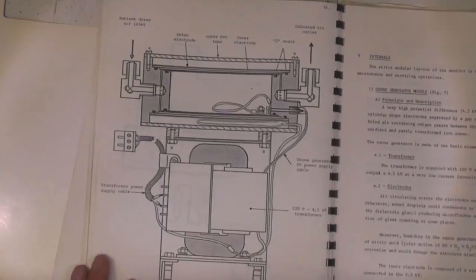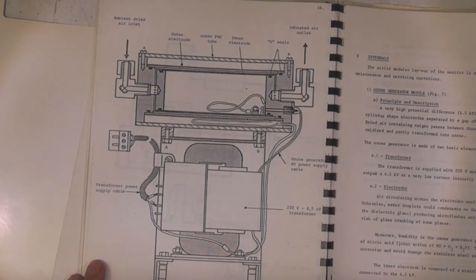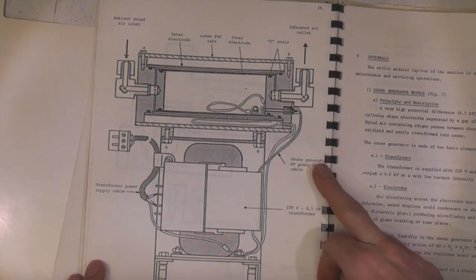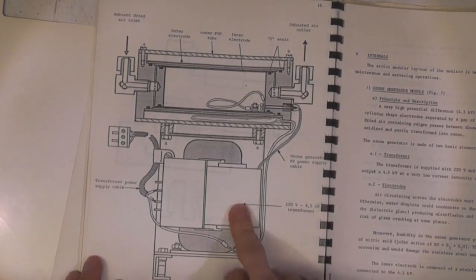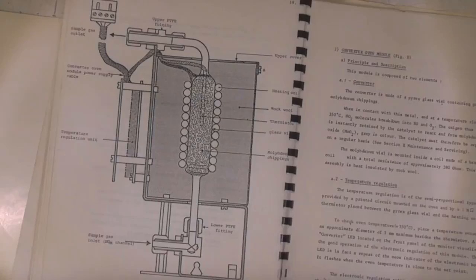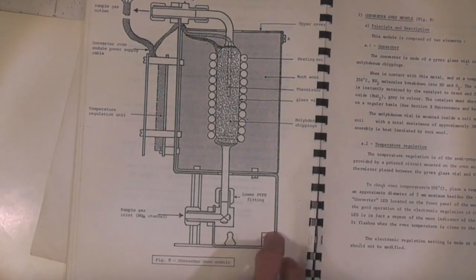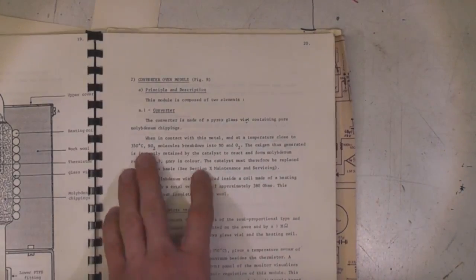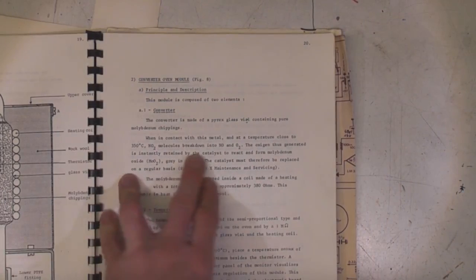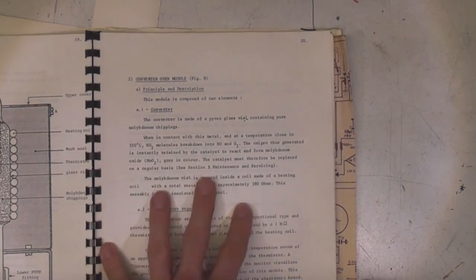This is the ozone generator, basically using high voltage to convert some of the oxygen in the air into ozone, and there's a nice 4.5 kV transformer in there which I'm sure we'll have some fun with later. This is the converter oven - a glass vial with pure molybdenum chippings - and when in contact with the metal at 350 degrees C, NO2 breaks down into NO and O2. This molybdenum is a consumable.